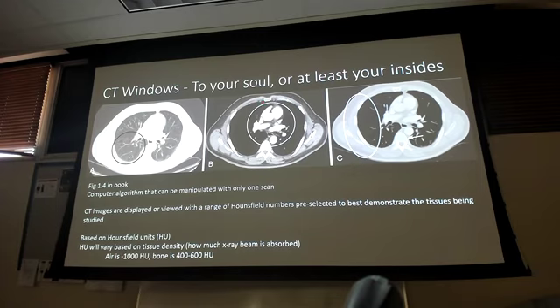We'll talk about some of the heart stuff in the second block. I can really make out my musculature really well, combined with my subcutaneous tissue, right? All of that is kind of sitting in there. So that's my soft tissue window, so I can do that.